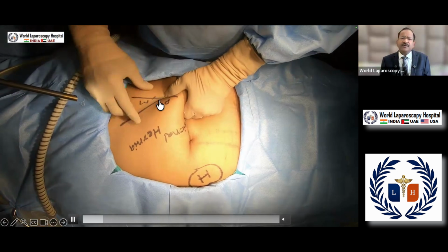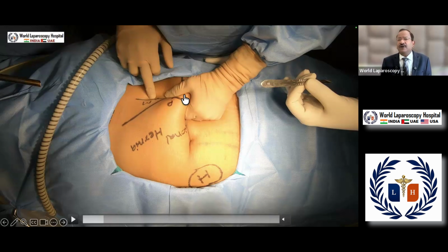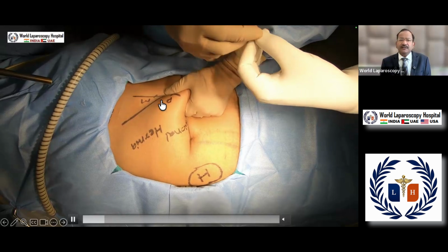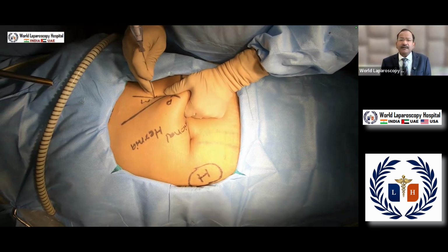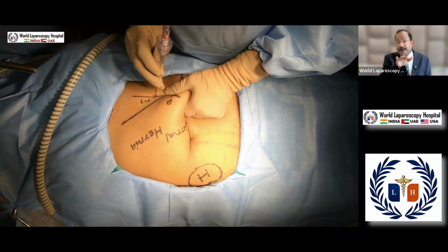And now you will stretch it down here, and it is stretched. You have to hold it this way, and it is easy to hold this way because the patient is anesthetized and has muscle relaxation. So, now it came below the costal margin, and then you give one small stab wound, and after that the Veress needle should be pointed towards the stomach like this. You should not point it towards the anus. It should be perpendicular to the abdominal wall. Even at the umbilicus we go perpendicular to the abdominal wall, because we lift the abdominal wall. But here perpendicular is towards the stomach.